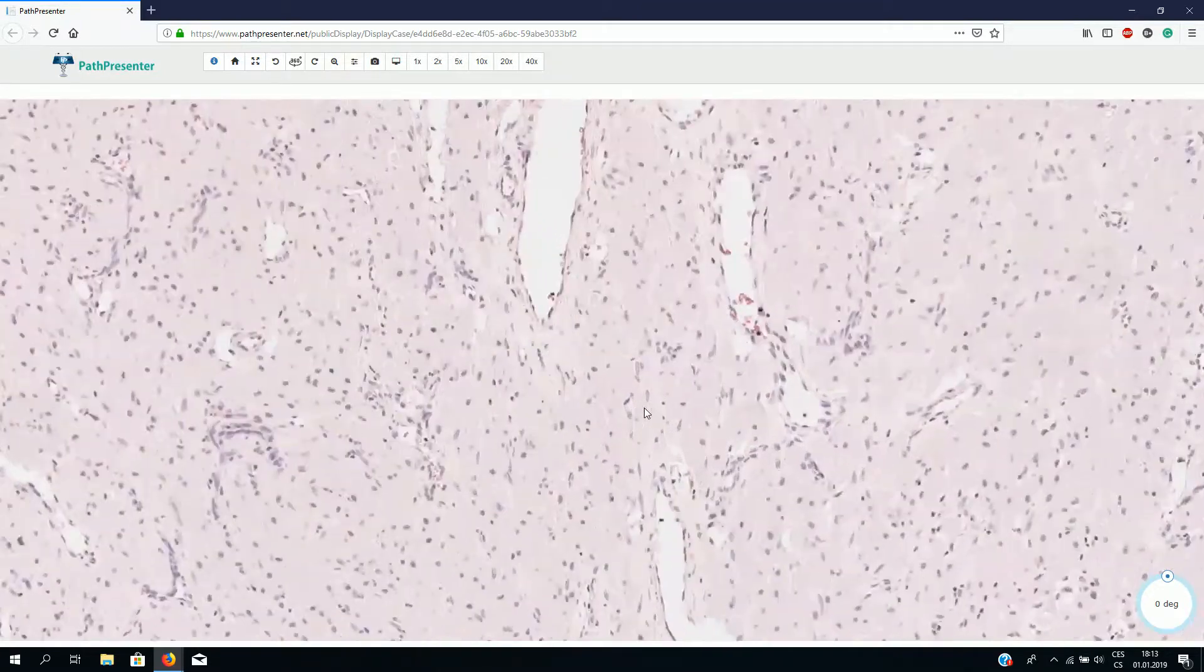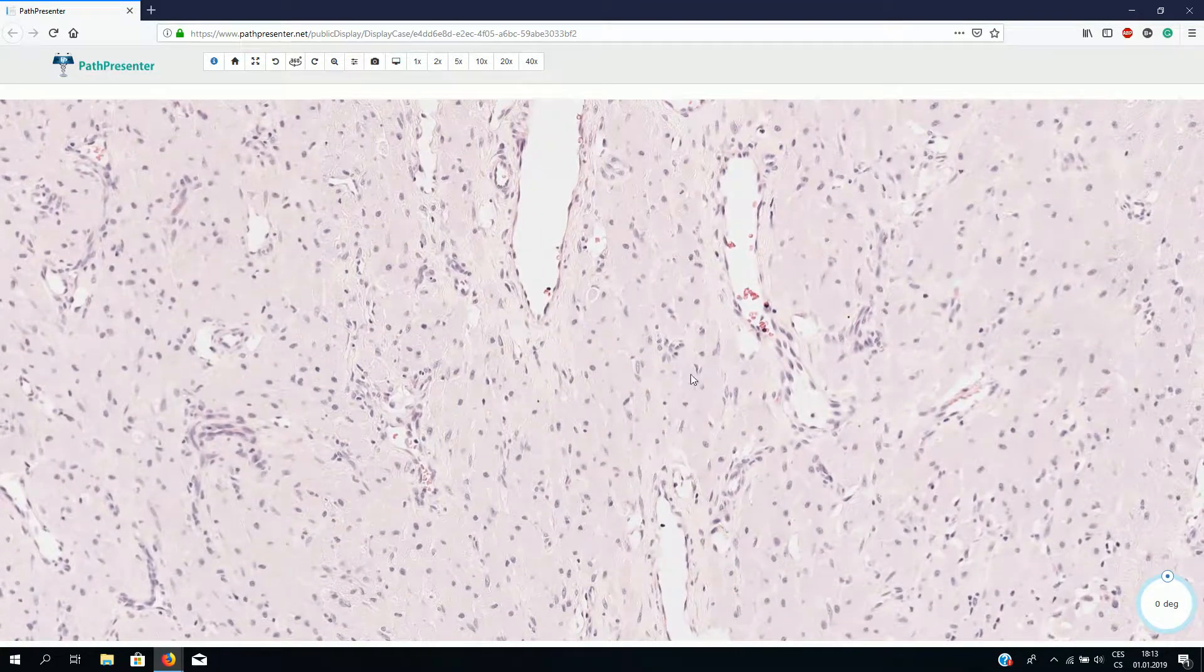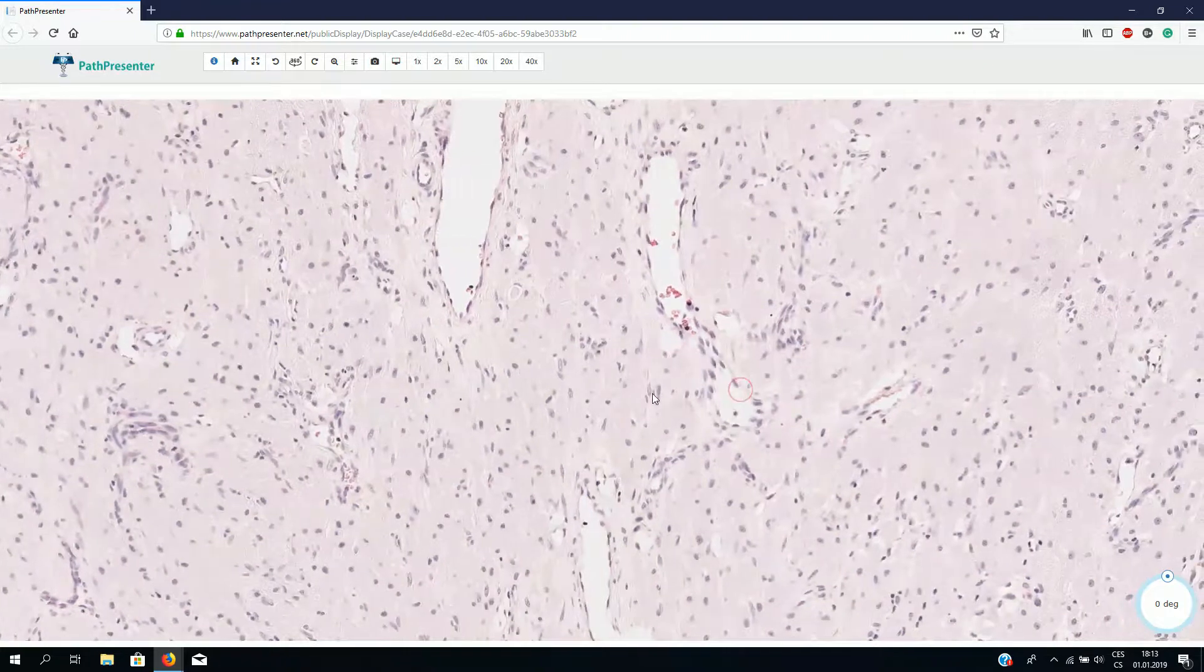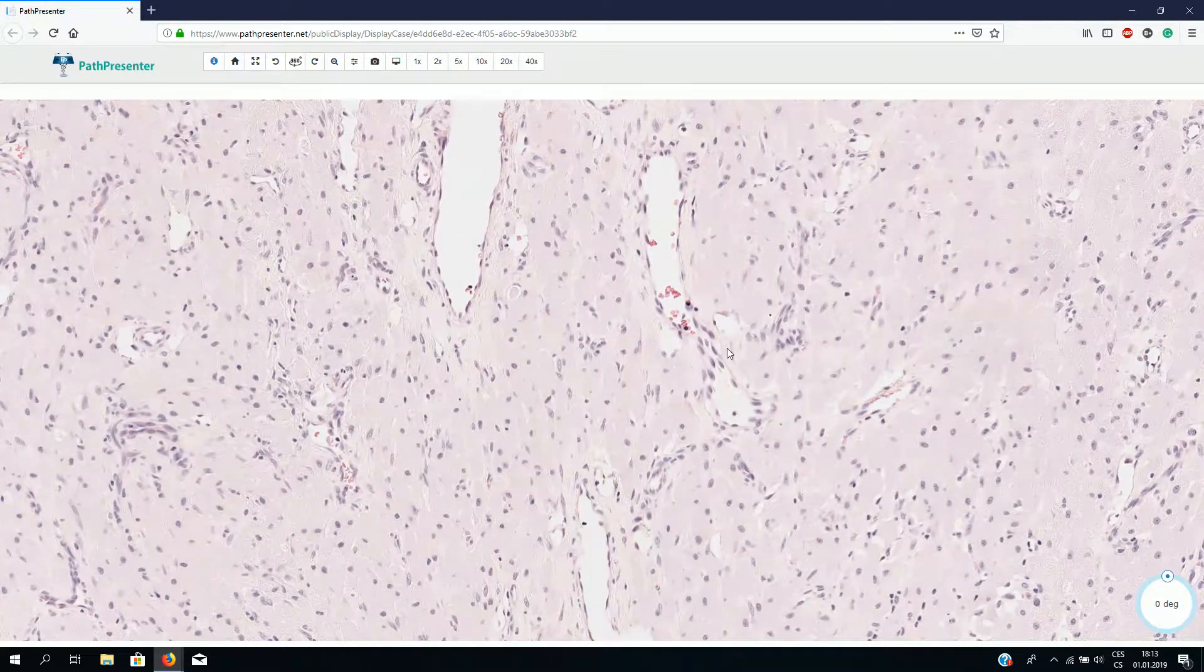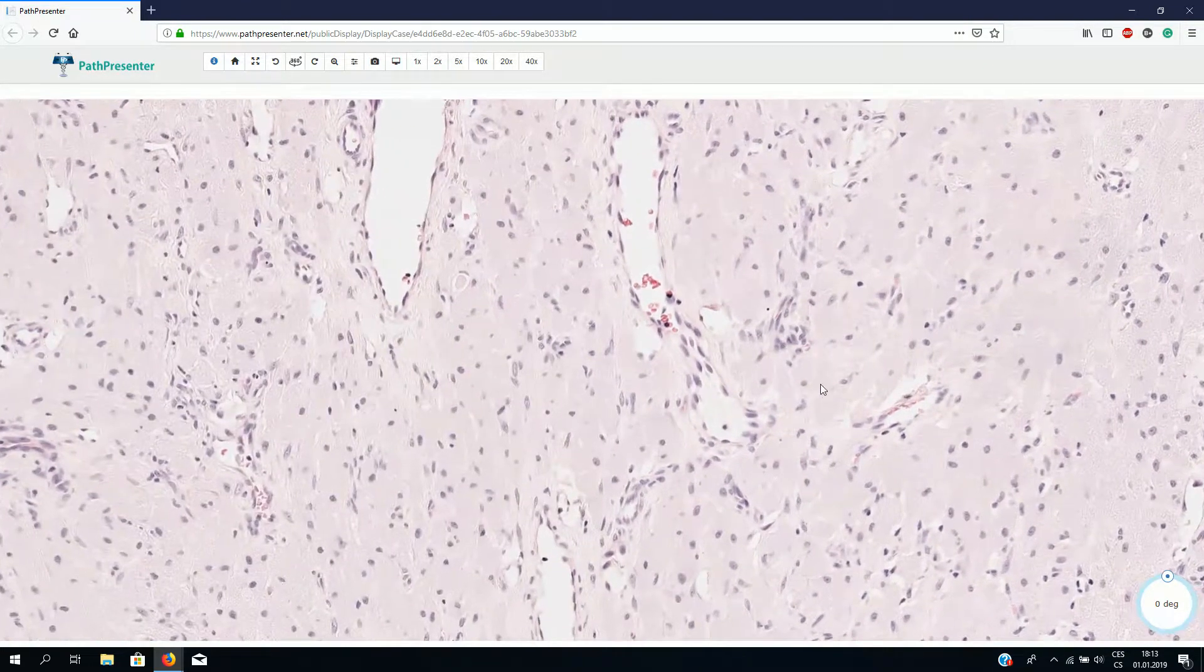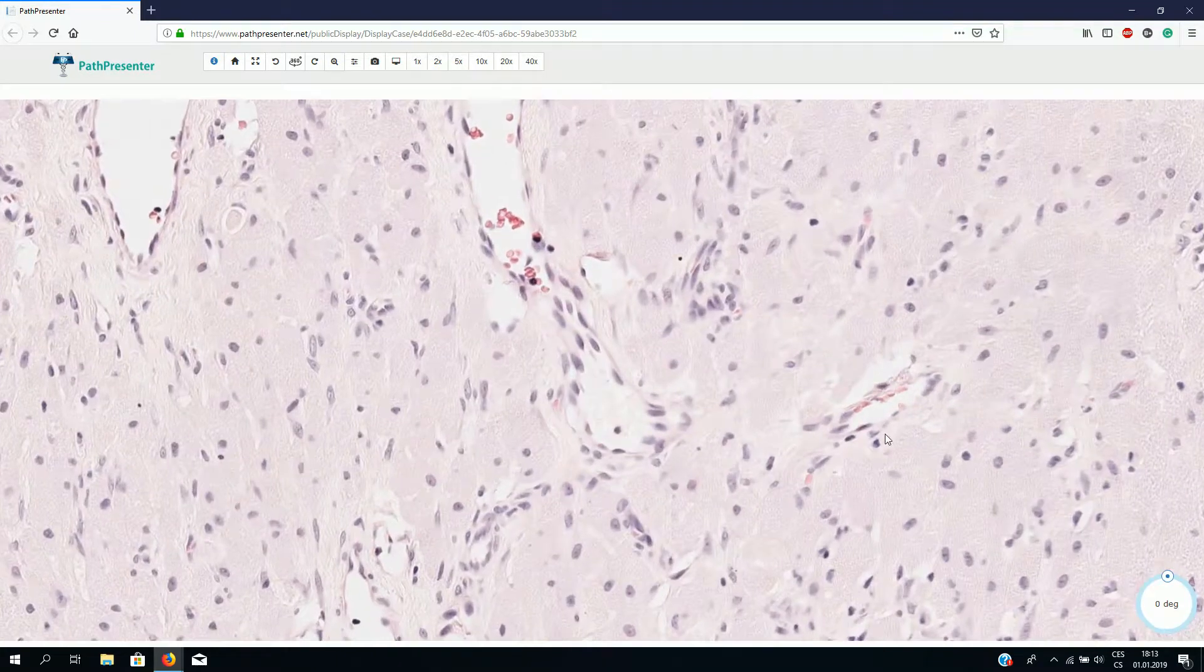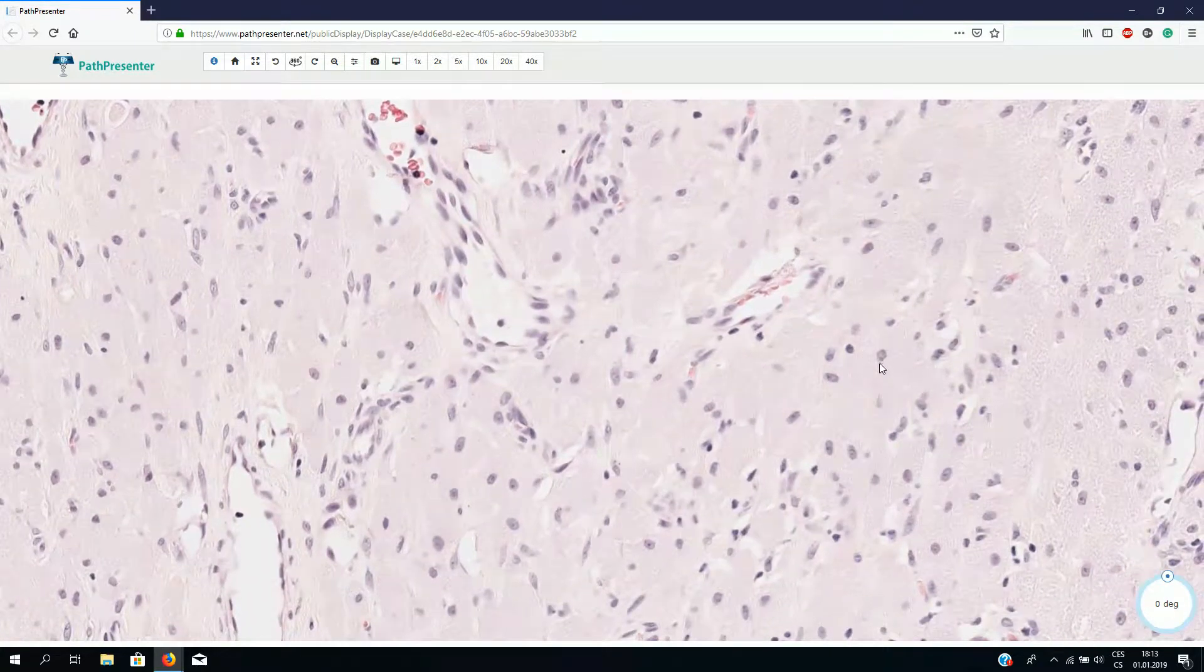The cells have granular, slightly eosinophilic, quite voluminous cytoplasm. The nuclei are typically small, round to oval shaped, sometimes with inconspicuous nucleoli.